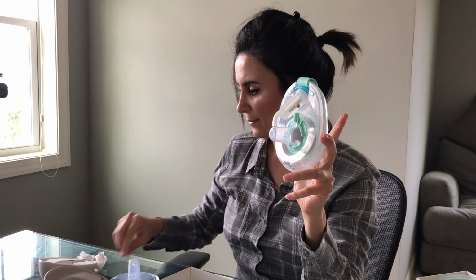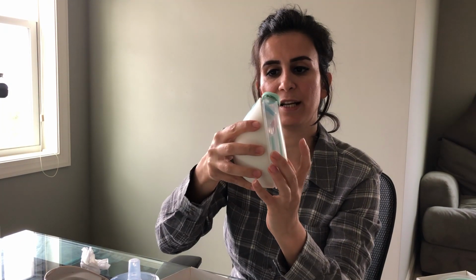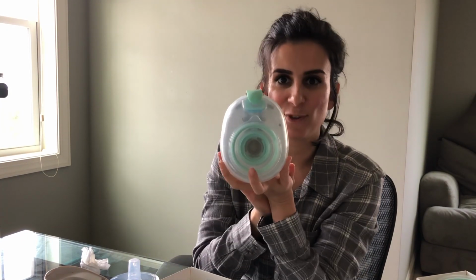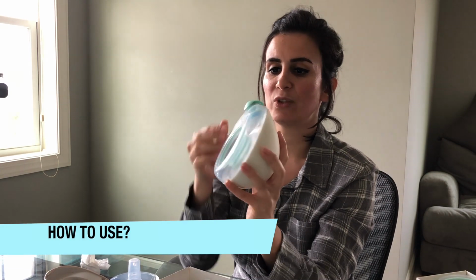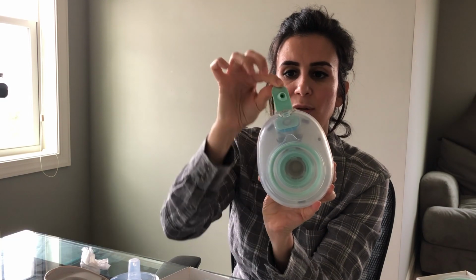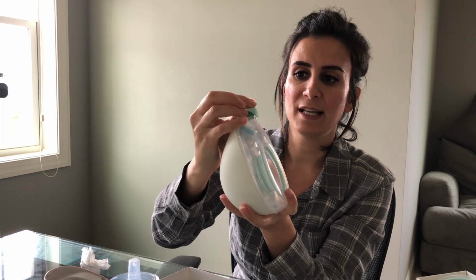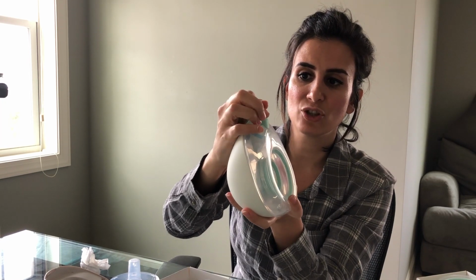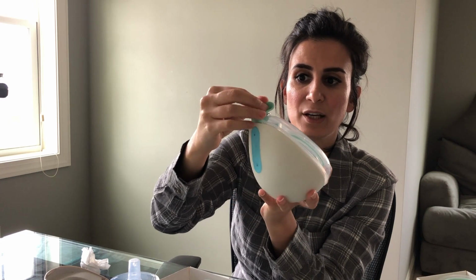You take this, and then you take the 2.0, and you put it on. And it's ready to be used. So when you want to use this, you want to make sure that this little blue disc is actually on inside, and you want to make sure you're maintaining the suction, so it has to be on correctly.